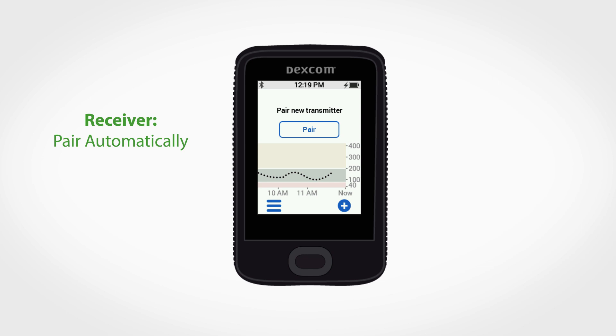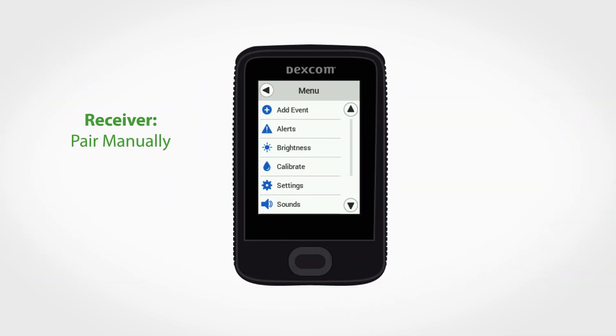To automatically pair a new transmitter from your receiver, wait until you get the pair new transmitter alert and then tap pair new.